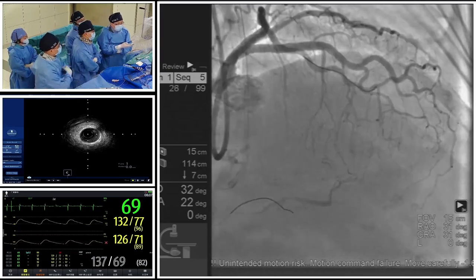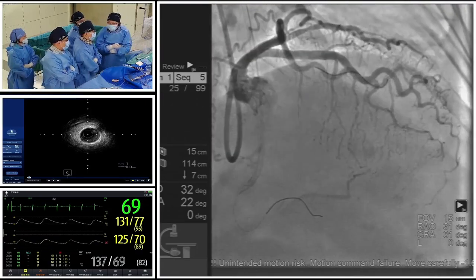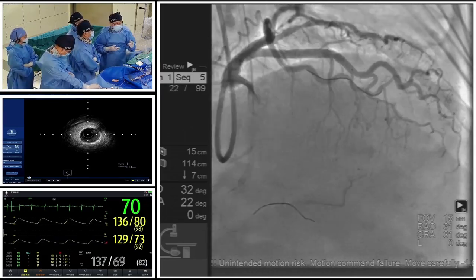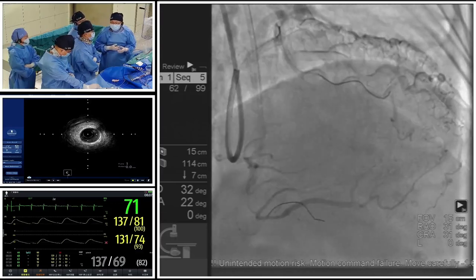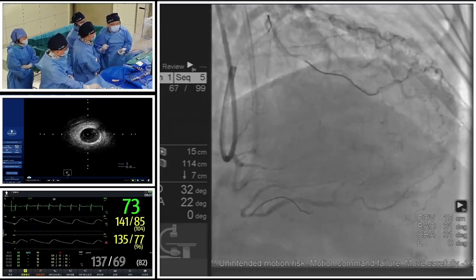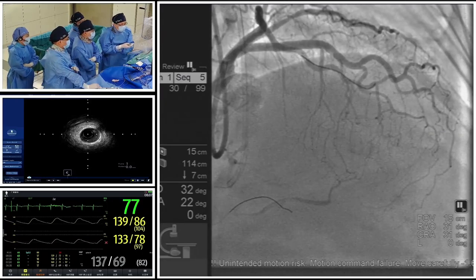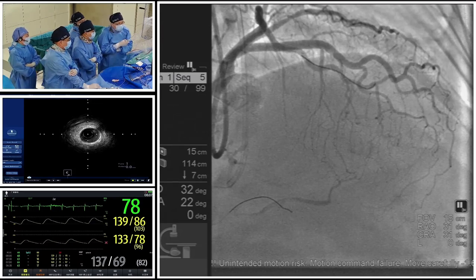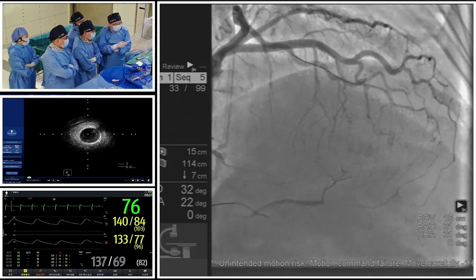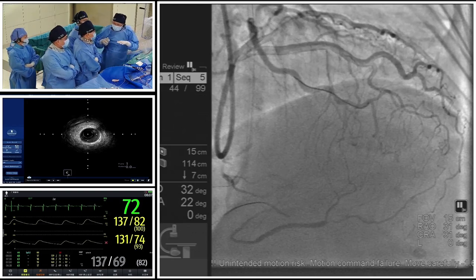And then this is the left coronary artery angiogram. We use a BL3.0 guiding and one tip and trick is to put a workhorse wire into the circumflex to make the guiding backup support, because we also could see the left main is very short. So this is the angio. We can see several septal collateral channels from the LAD, maybe the first diagonal branch and the septal branch and the second septal branch, but very tortuous in some segments, very tortuous, because this is a very small LAD.